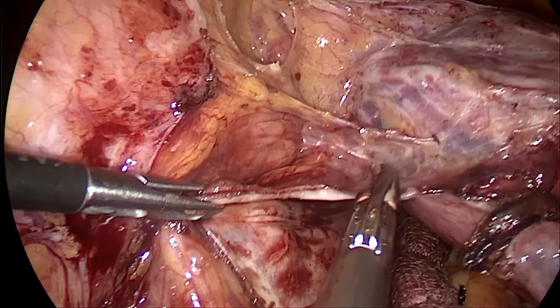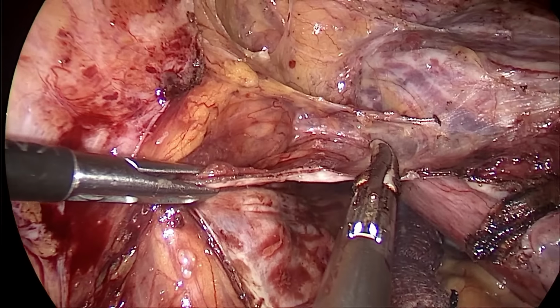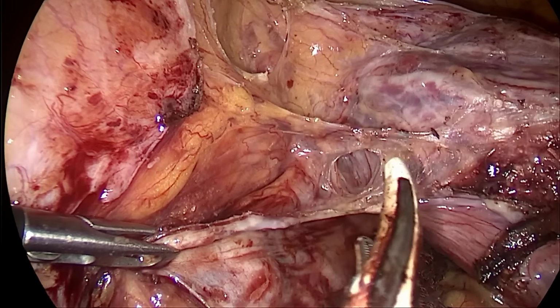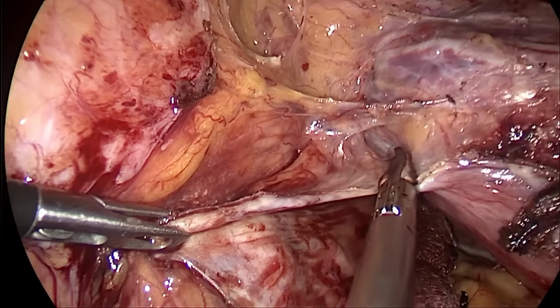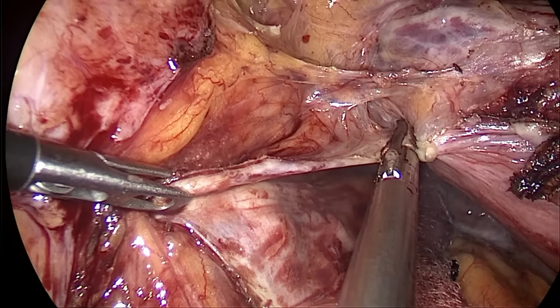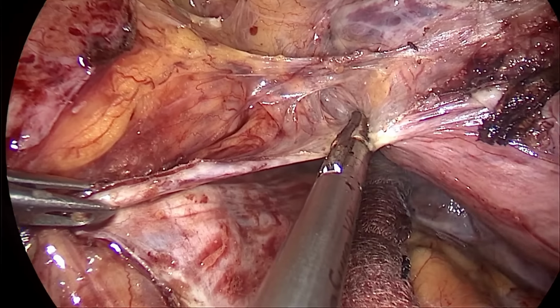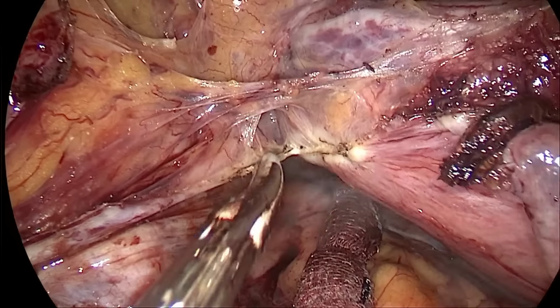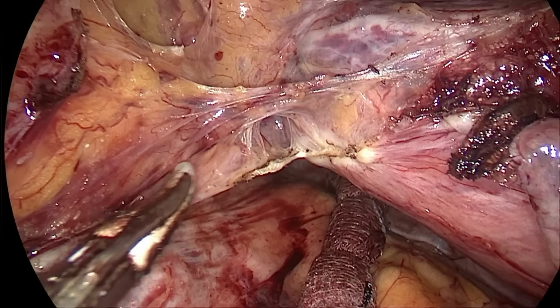That's the posterior leaf of the broad ligament. So in this case we don't need full ureteric dissection, because the cervix is not involved. So type A hysterectomy is sufficient. But the scan shows that there was a deposit on the left side pelvic peritoneum.